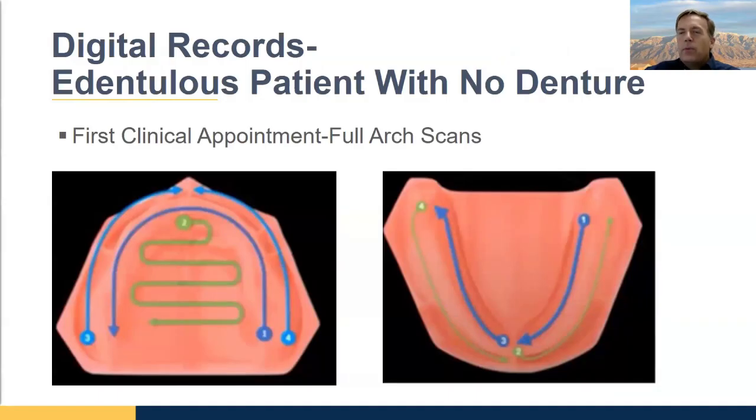So how do you deal with a person who doesn't have any denture? Can you do a digital workflow for them? Absolutely. Like I said, it's going to take 4 appointments because we're going to have to do a bite block, but that's okay. And you can do this analog. Since the lecture's on digital, I'm always trying to pick the most digital workflow I can find. So if you want to just take a preliminary impression with alginate or PVS or whatever, that's fine, because we're going to be doing a border molded impression at our second appointment anyhow.